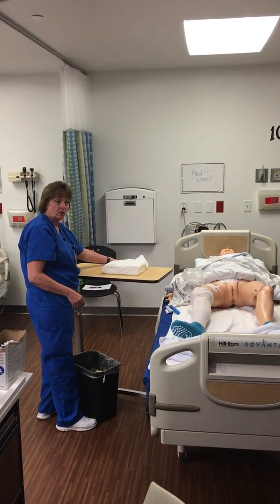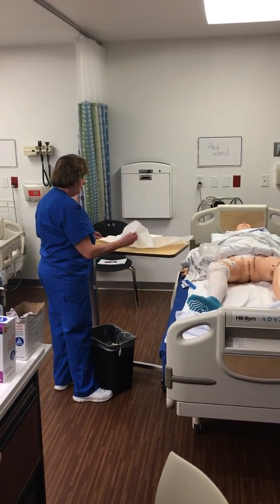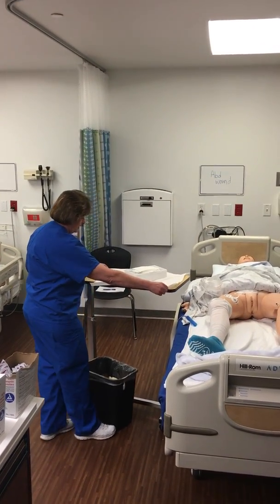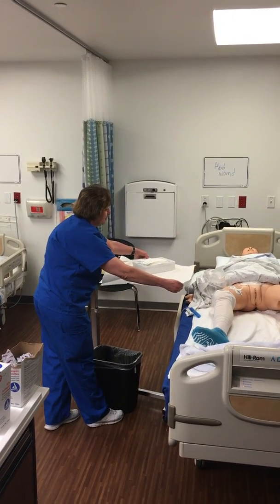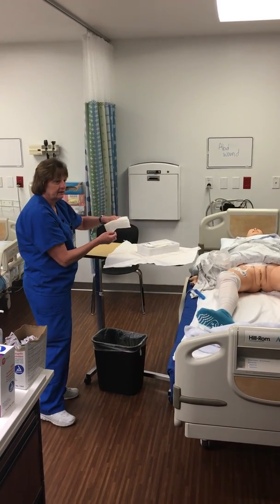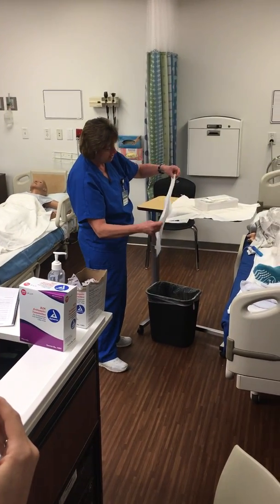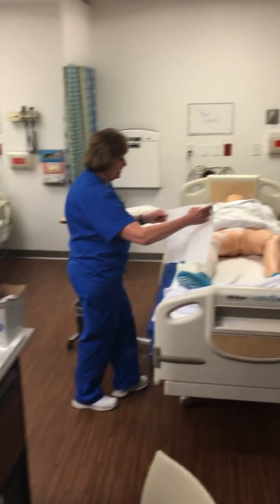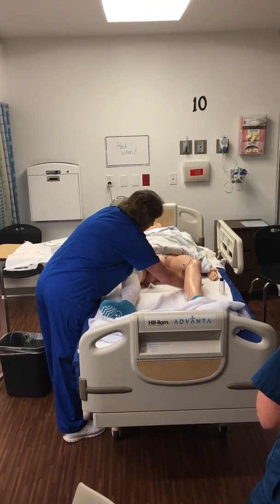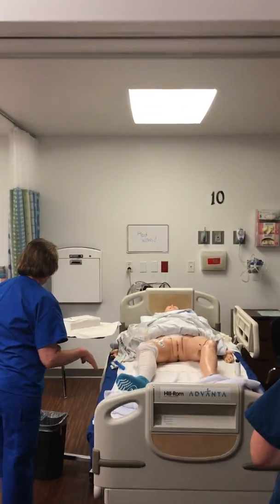So if you guys remember, I go away, side, side, and then we want to pull this one forward like this. Now so that I don't bump into it all the time, I'm going to move it off and make the corners a little bit like that. I want to pick everything up from the center — I'm not going to dig my fingers in there because that's all sterile. This is my little drape that I'm going to put underneath the patient. It helps catch the betadine. It's not really considered sterile because it's almost impossible to keep it sterile when it's going down there, but I'm going to do that just so I don't get the bed all full of stuff.